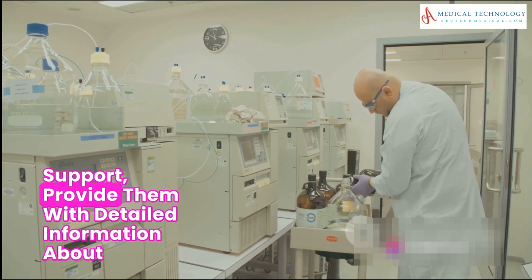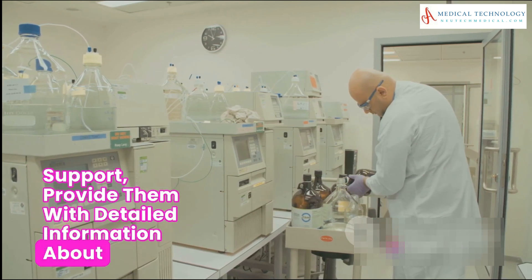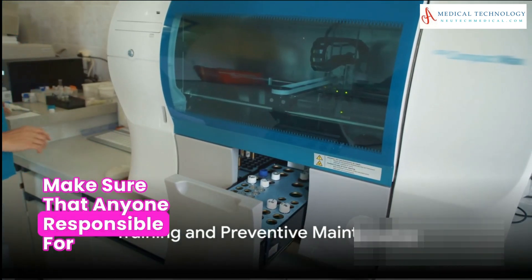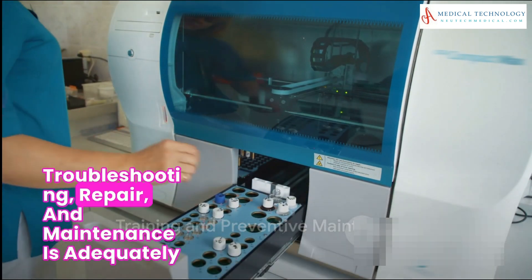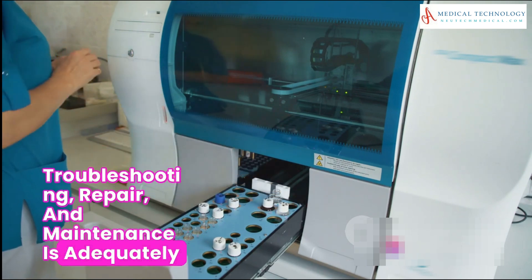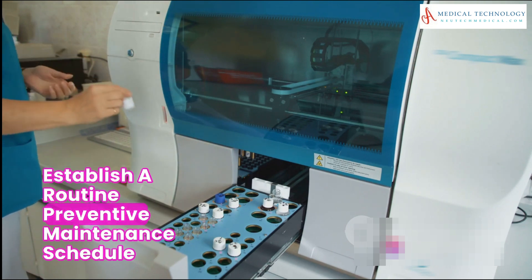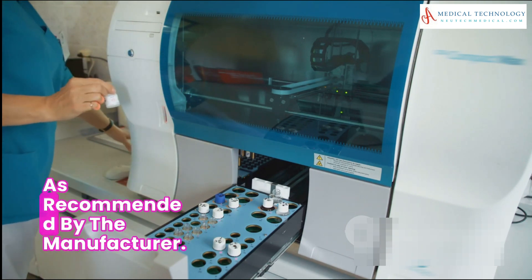If any issues persist after your troubleshooting efforts, reach out to the manufacturer's technical support and provide them with detailed information about the problem and the steps you've taken. Make sure that anyone responsible for troubleshooting, repair, and maintenance is adequately trained and certified by the manufacturer.